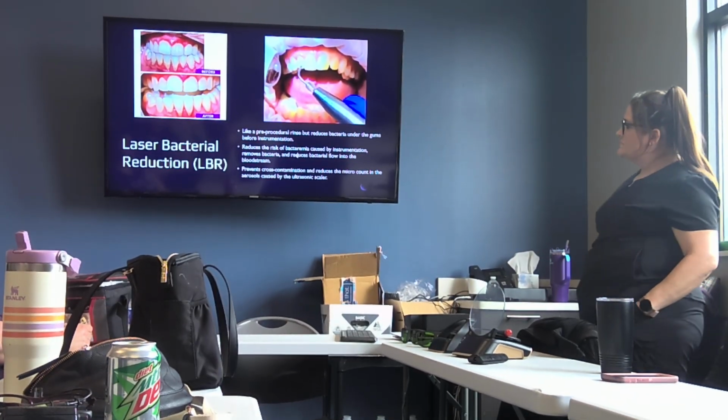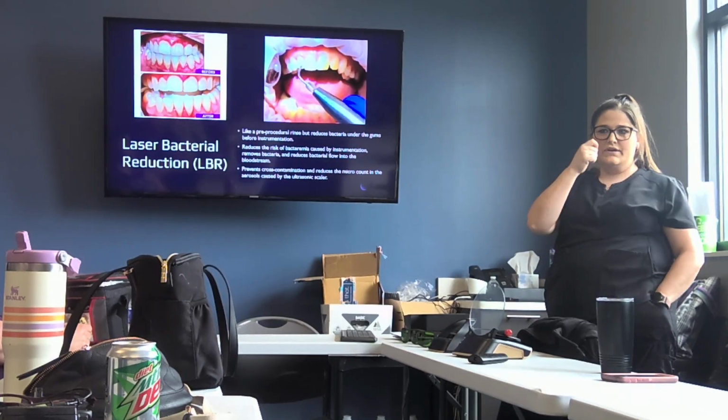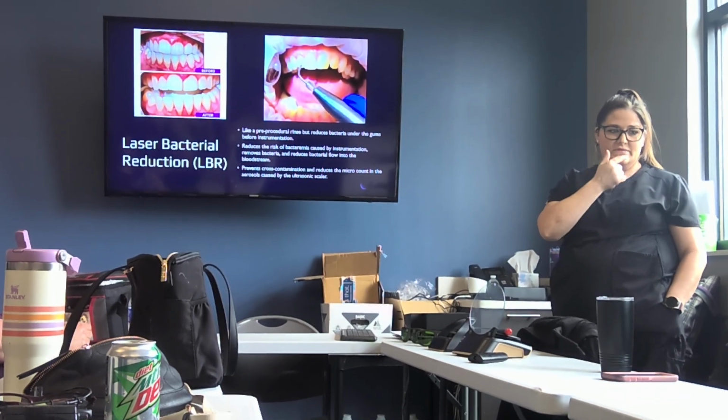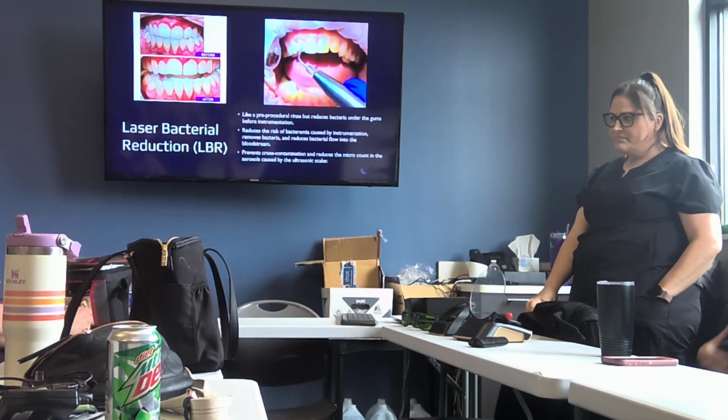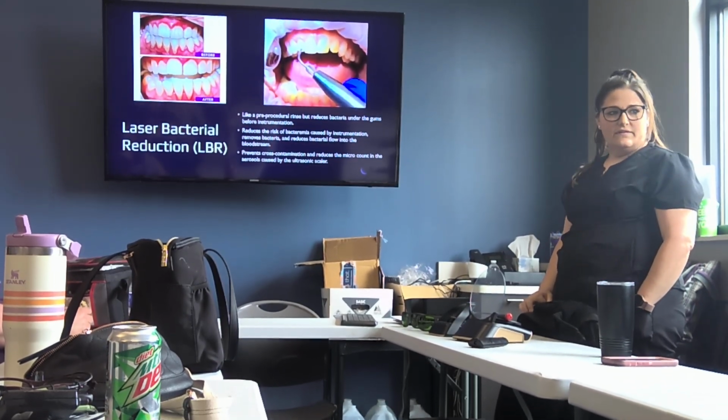So the LBR is really quick. You just run it through underneath the gums. You just drop it in the pocket and run it along.